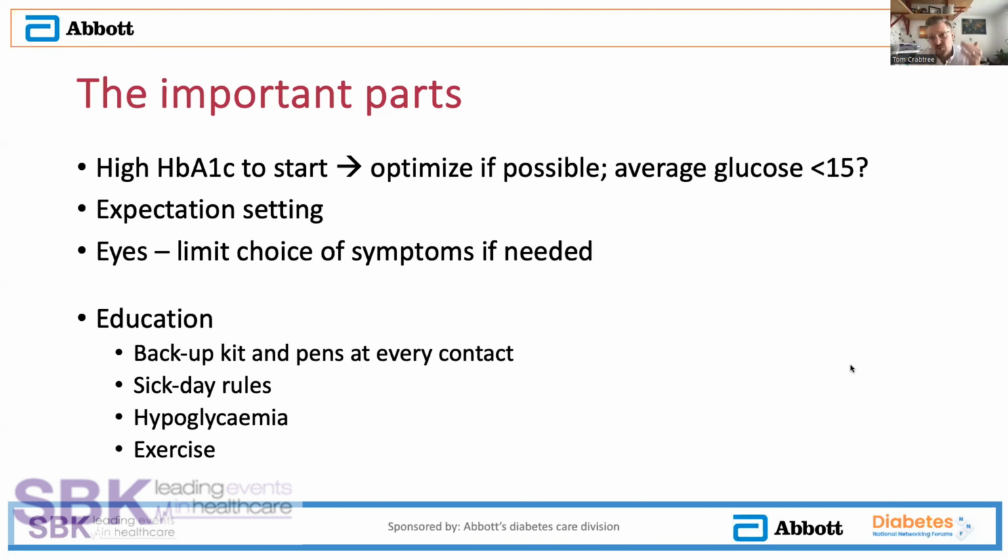And exercise, and talking about either activity mode, temporary targets, whatever is relevant for the pump that they're using, but making sure they know to use that. Trying to avoid carb loading beforehand, but to drizzle in carbohydrates throughout exercise, particularly if their blood glucose is at the lower end.